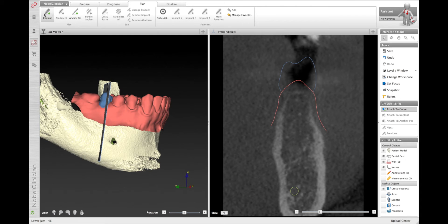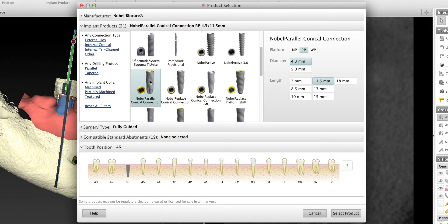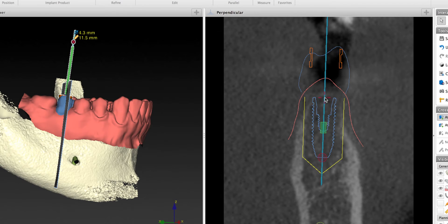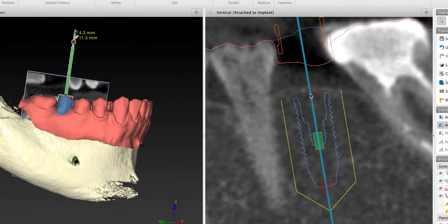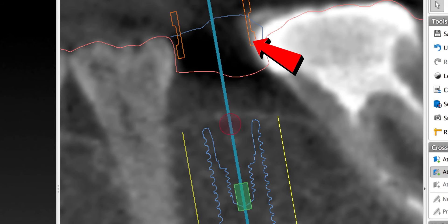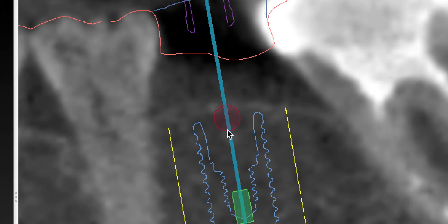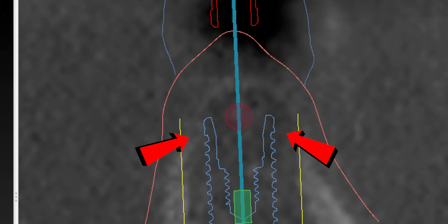During this presentation we're going to ignore the excess soft tissue and start to place the implant in alignment with the temporary wax-up we've created. We'll pick a parallel CC implant with a conical connection. Placing the implant at the crestal level, you'll notice the bone is very thin around this area — quite typical when placing too high. The orange sleeve over the top of the implant shows there's not enough space for a fully guided case, so we have to go to a pilot drill — the first two-millimeter drill — which will give us depth and angulation, then proceed by hand.